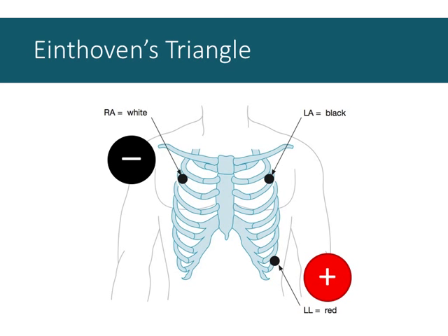All of the information that we saw in those last two slides can simply be rotated and applied here. The vector is generally from upper right to bottom left. Repolarization is in the opposite direction. Here I'm showing you another electrode, this left arm electrode, on the left side of the figure, but to your right as you look at the slide, which serves as a ground electrode to account for any background noise or background activity.